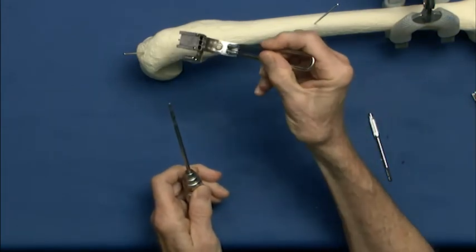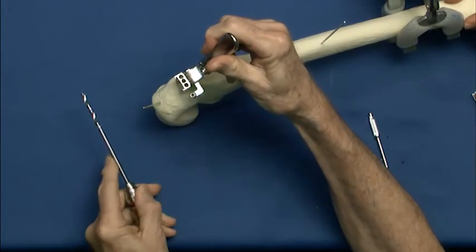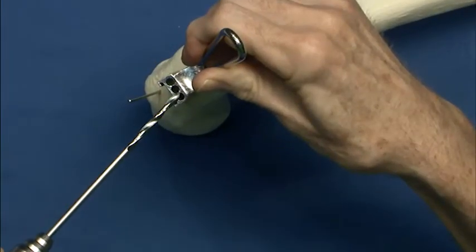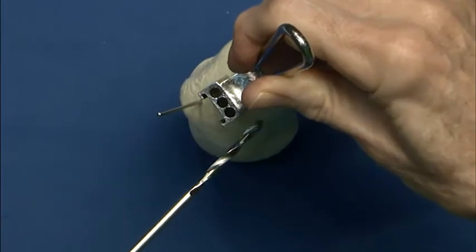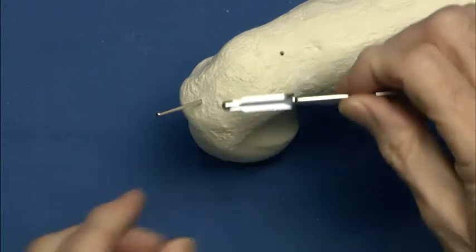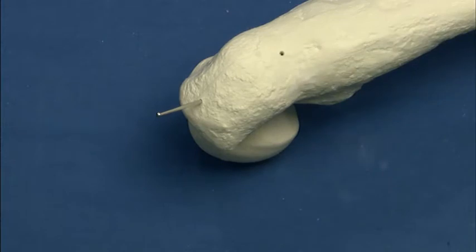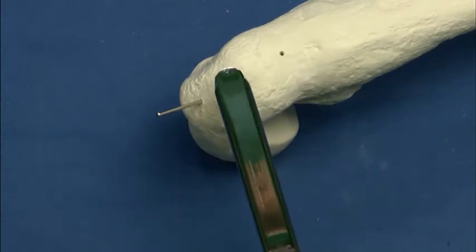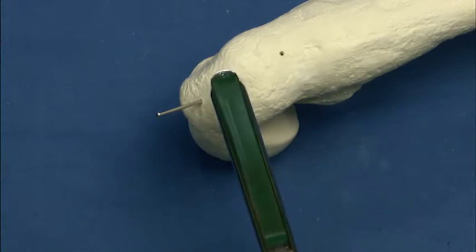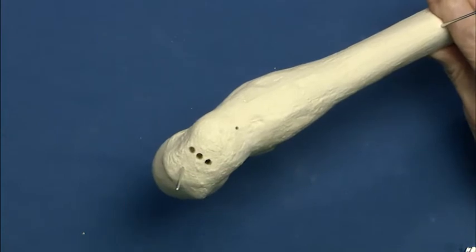You would take this triple drill guide and use these 4.5 millimeter drills, and then you're going to have 3 holes sequentially, and you're going to follow that today with a router, which will then enlarge these holes so that you can easily insert the seating chisel, which is a replica of the cross-sectional profile of the blade itself.